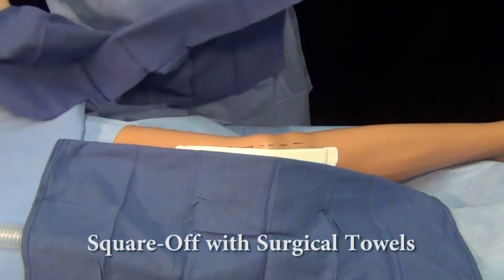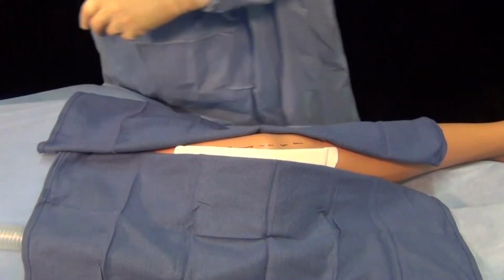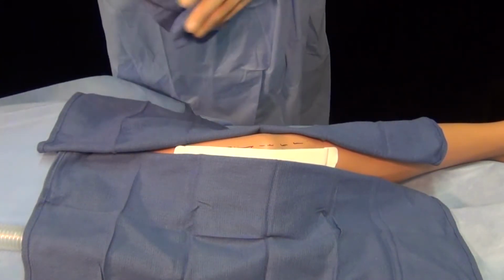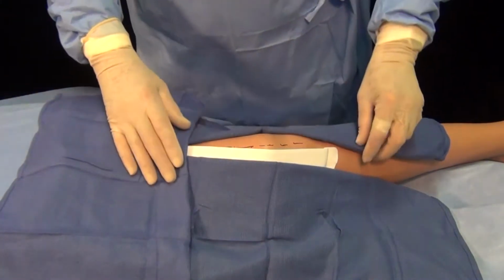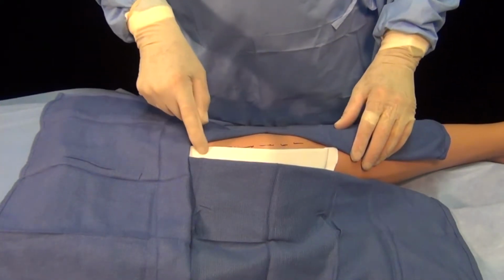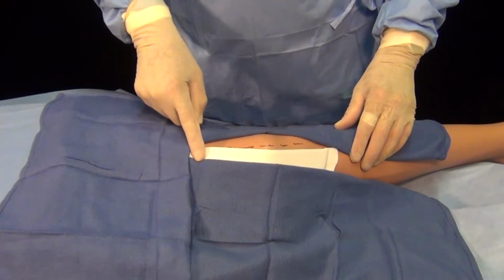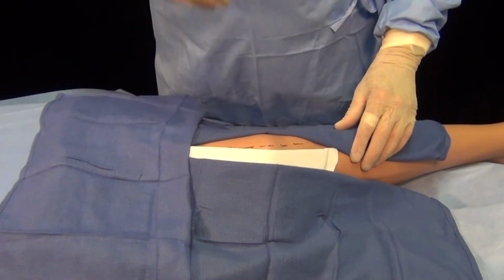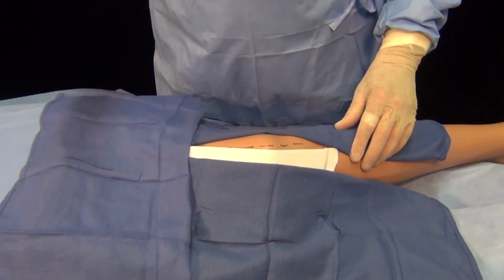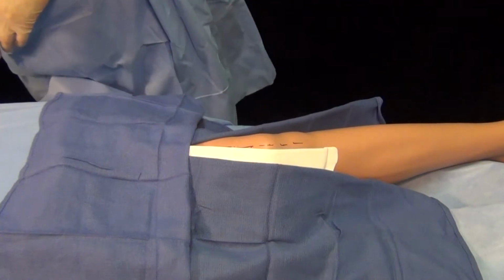Now, in this particular instance in the knee, it may well be that your surgeon does not want to use towels but uses a surgical barrier drape and also will use a tourniquet. In those situations, the device should not be applied until all these manipulations are completed. In other words, the outer barrier drape is on, the tourniquet has been applied, and the wrapping has been removed. Then you would put the device on, and then you can towel off, as we're doing now.